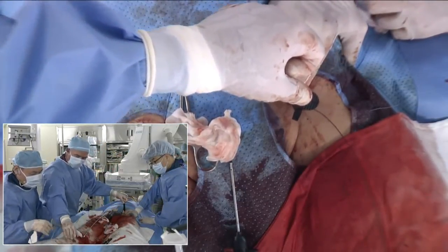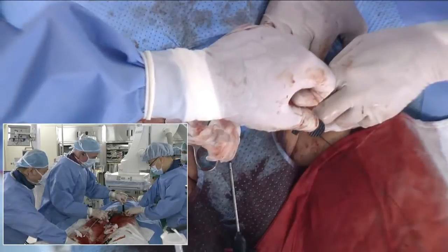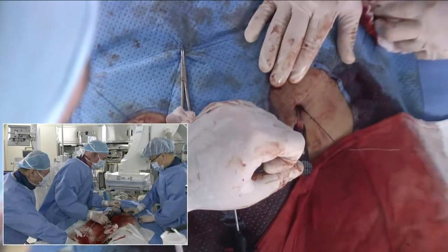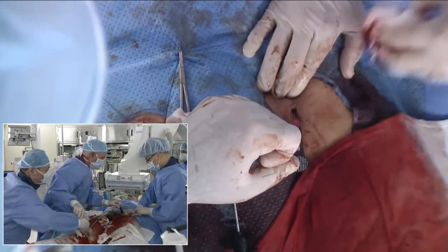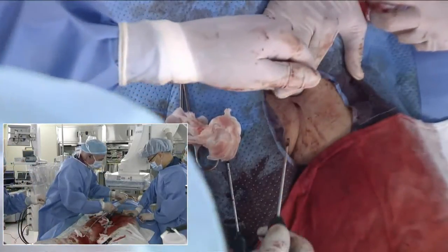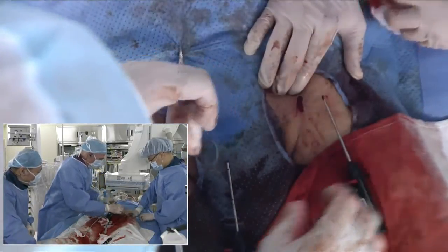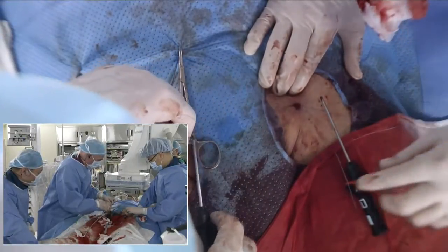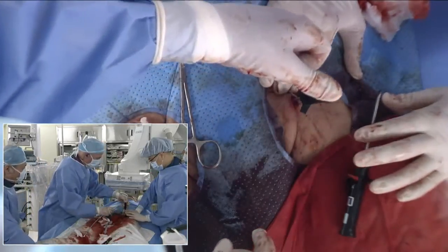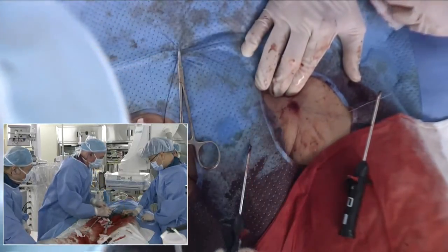What flush? Saline flush? Okay. Why don't you let up, Dr. Park? Okay. So we're pretty good here, I think. We're really close. I'm going to go ahead and take the wire out, and then go ahead and go down with the knot pusher again on this side. Good.